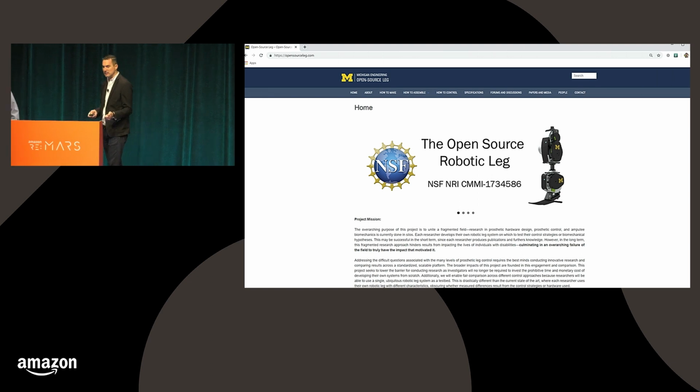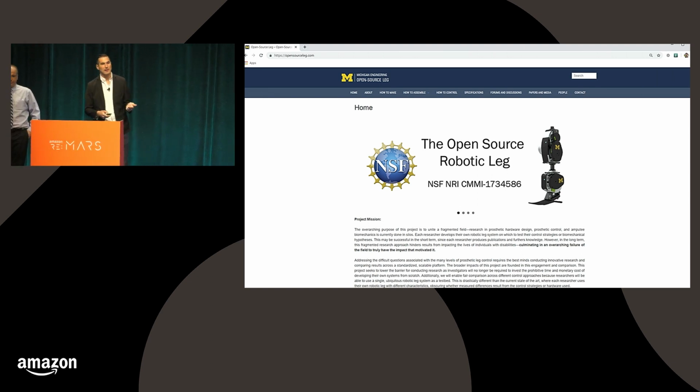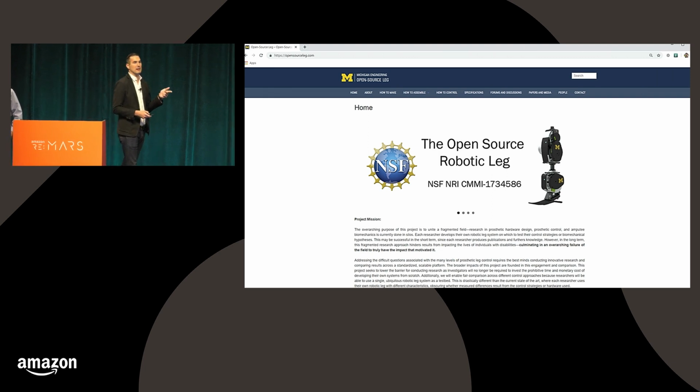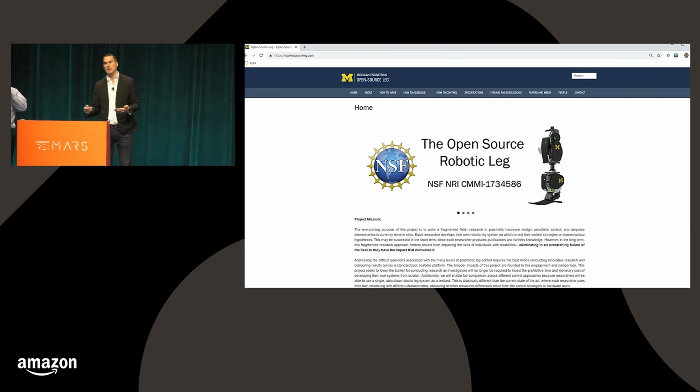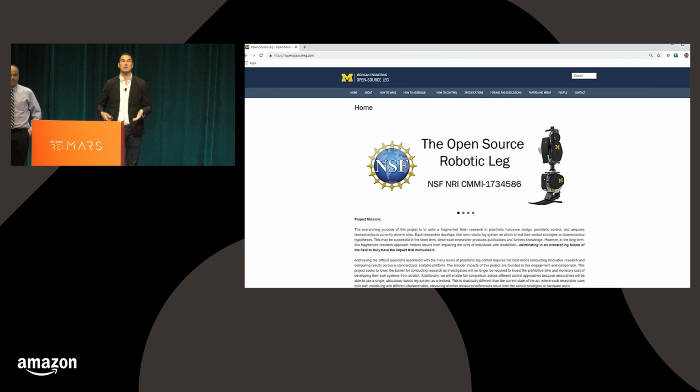This is an example of the landing page. There's a bill of materials. There's all the solid model files. There's detailed step-by-step information about how to assemble the system and how to control it. And there's a forum for people to say what they like and don't like, or what design changes they want, or upload their own changes. So I hope to really foster this concept of this open source dissemination.